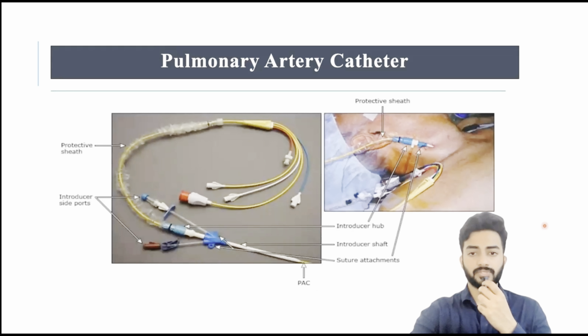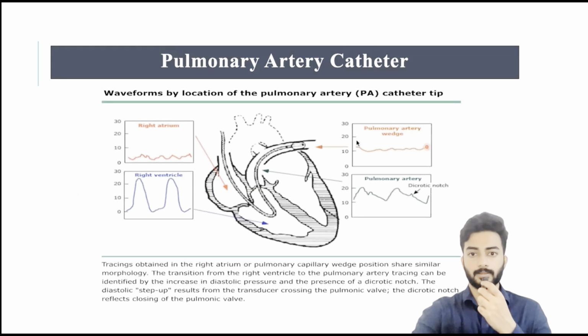And it has a protective sheath and the introducer side ports which I have already seen. This is how a PAC catheter is placed after putting the sheath. This we have already discussed.